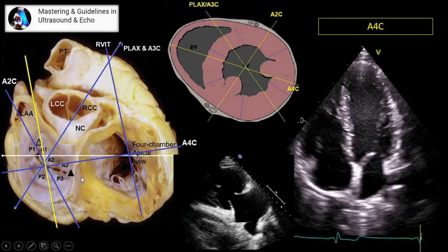I am not going to talk about this, just in the transesophageal presentation, I go into detail. But here, just keep in mind, depending on how much you twist your probe, and whether you are angling a little to the medial or lateral, you will see different structures and different scallops of the mitral valve leaflet. Here, if you twist too much, you will pass through this line. If you are fanning, it goes differently, you get a different structure.